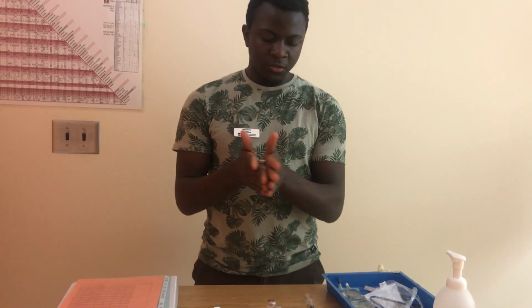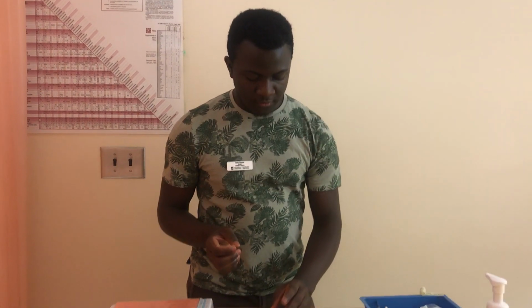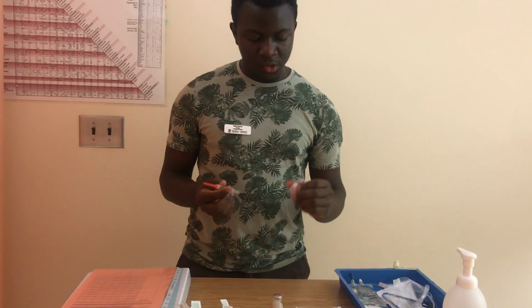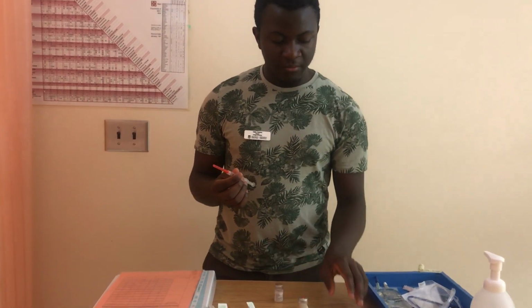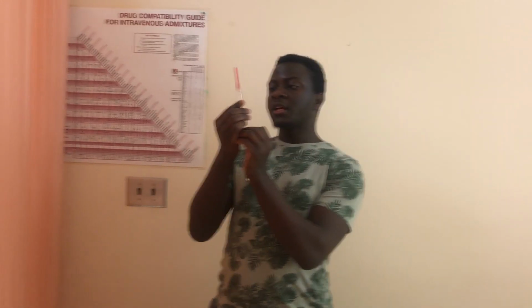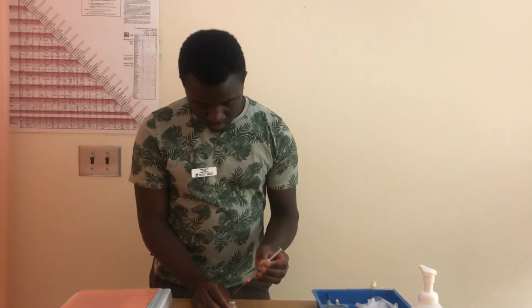I will gently roll this in my hands to make sure all the medication is dissolved, so that the powder dissolves within the fluid. Now I see that my medication is well dissolved and I can go ahead and draw my volume. For 75 milligrams, because this vial is 125, I have made my calculation and I'll be drawing out 1.2 milliliters to get my dose out of my 2 milliliter vial.